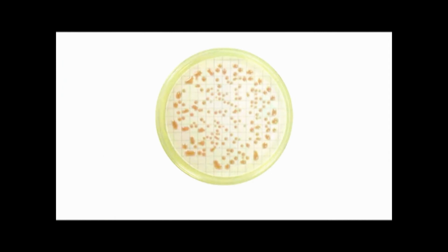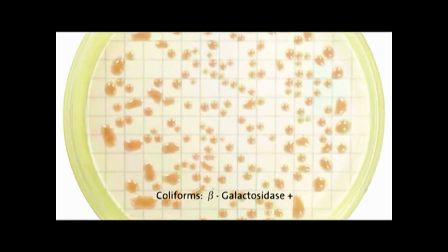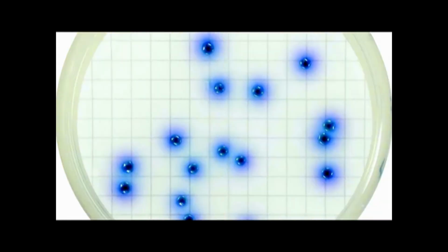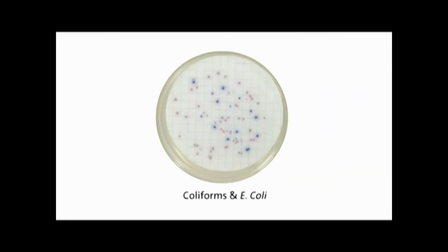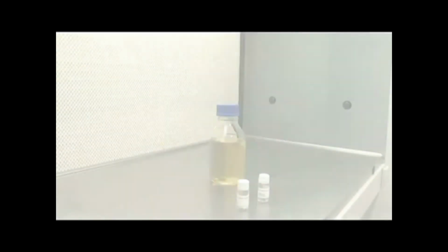Salmon-Gal forms a colored precipitate in the presence of beta-D-galactosidase and gives a salmon pink to red color for the coliform colonies. X-Gluc forms a colored precipitate in the presence of beta-D-glucuronidase and turns the E. coli colonies a blue color. However, the presence of the two substrates and cleavage of these by E. coli results in the formation of dark blue to violet colonies.